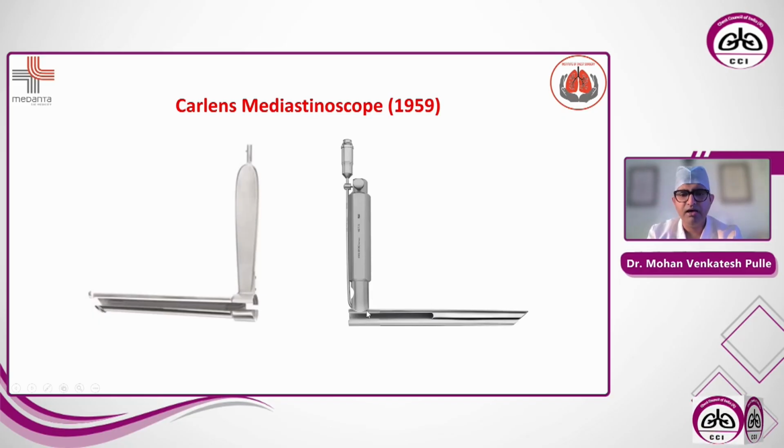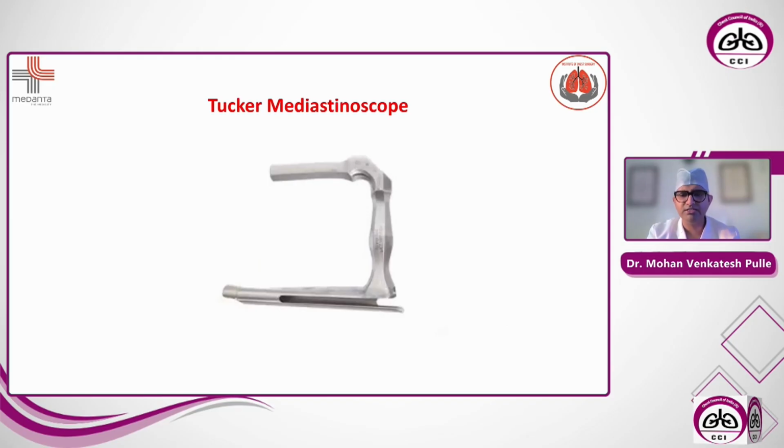It is L-shaped. You have a barrel with a curve, more like the rigid bronchoscopy that you do, where we put this into the mediastinum in the pretracheal plane. It is a fixed barrel, it doesn't open, it has a fixed diameter. There have been several modifications by various people according to their needs.